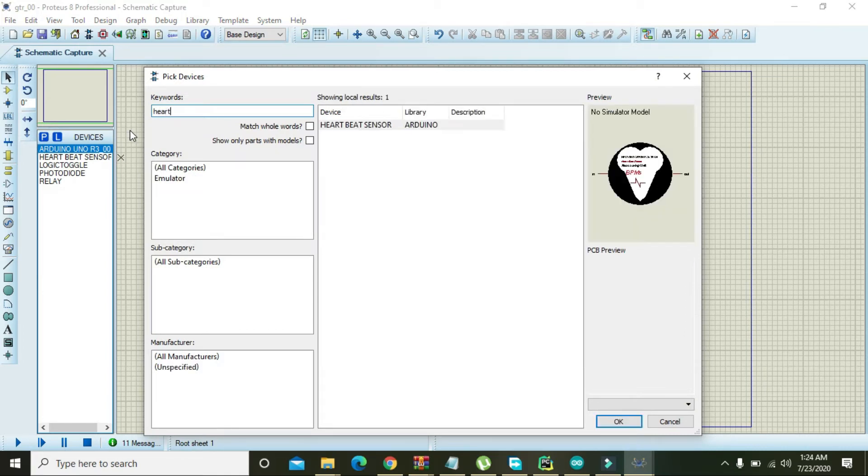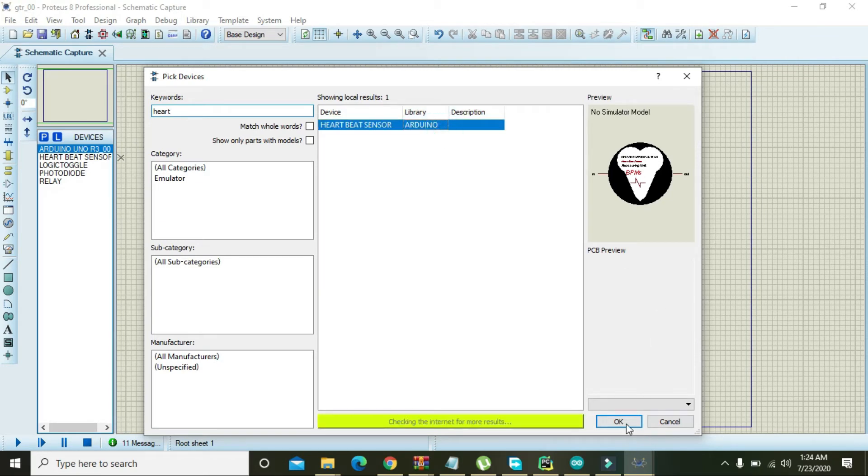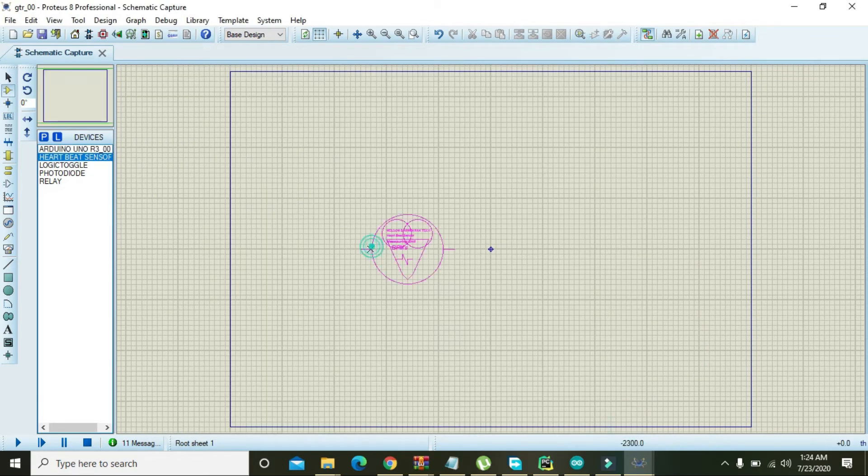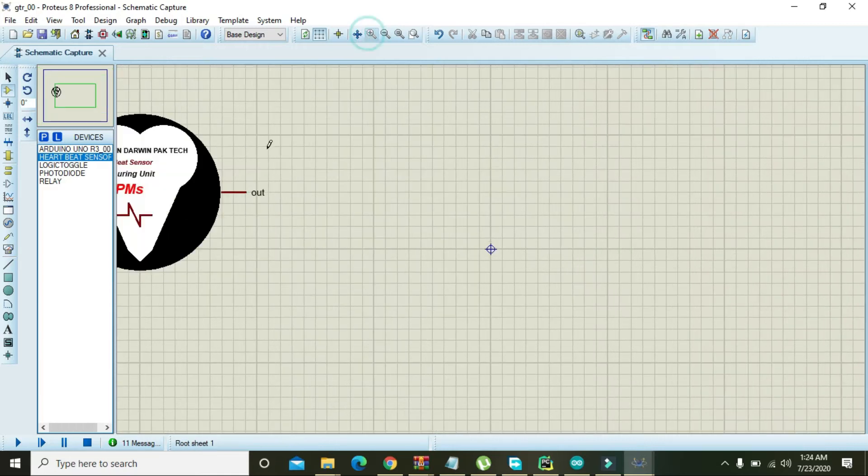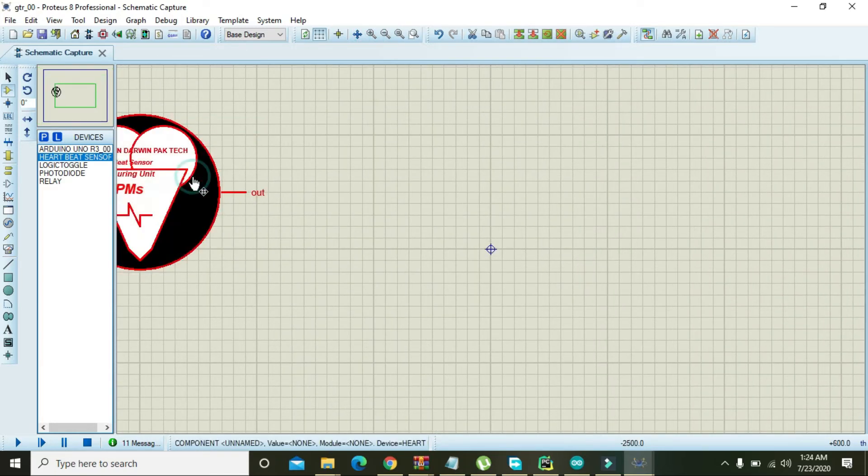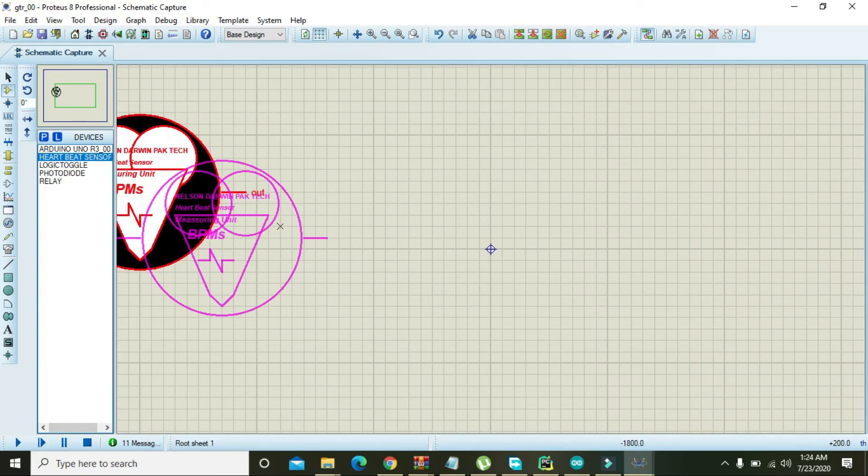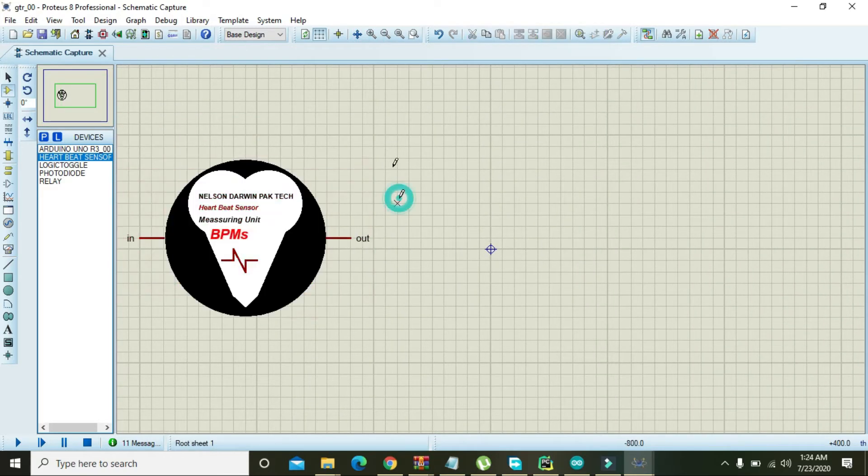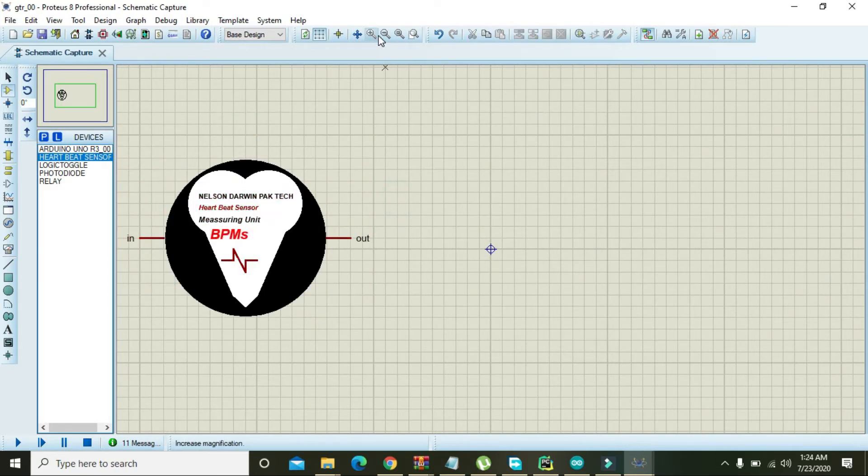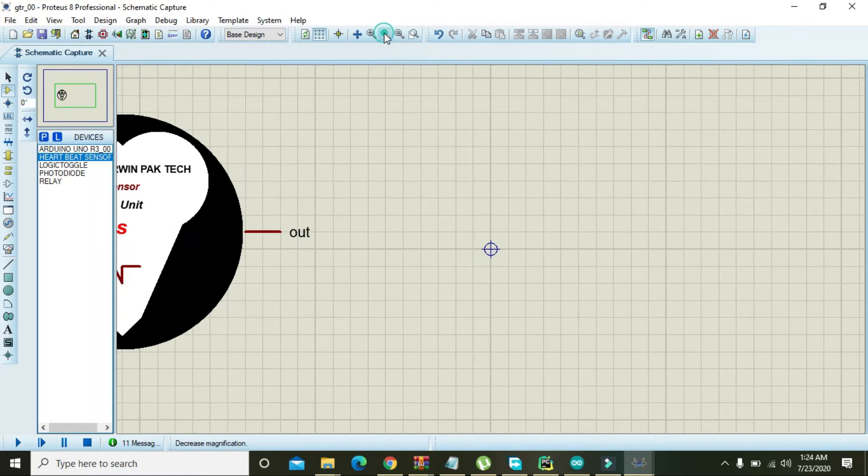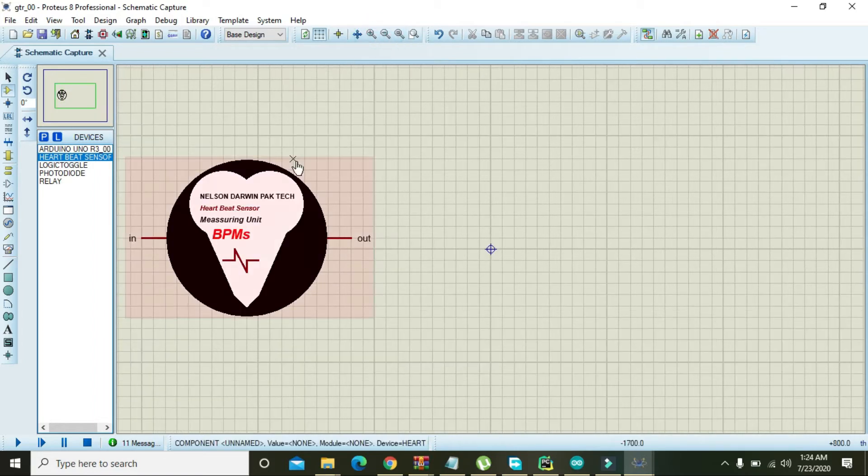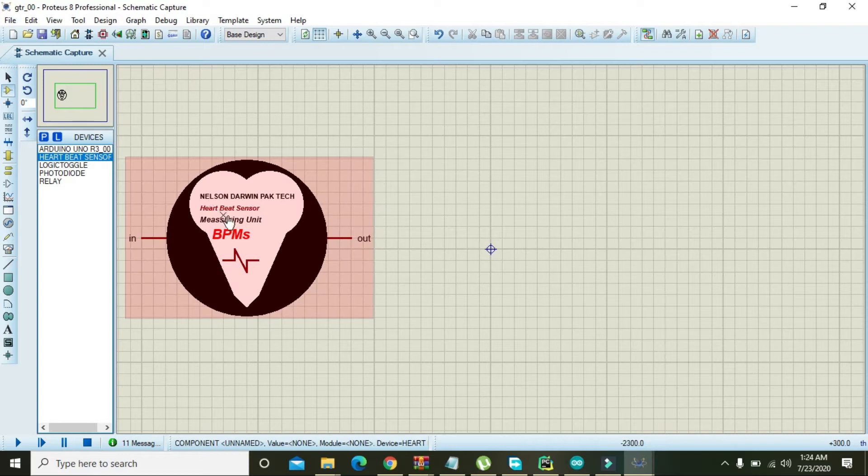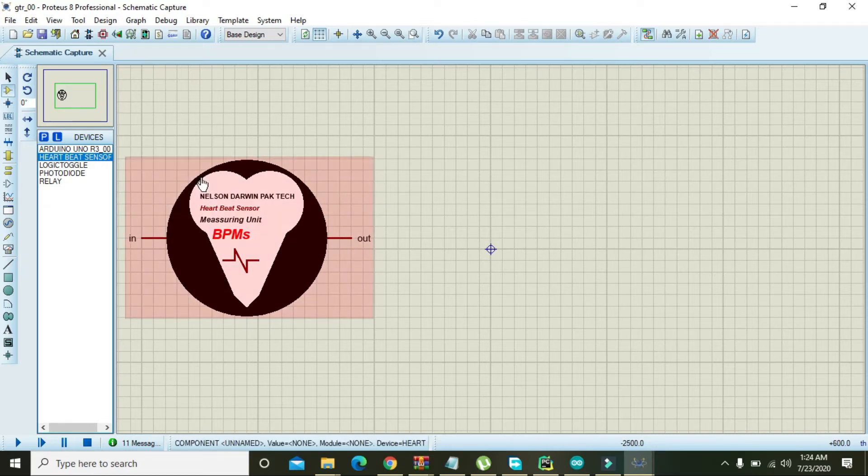Right, heartbeat, and you will get the sensor that is heartbeat sensor here. Okay, now you can place it, make it some bit zoom so that you can see it. Okay, now this is the best zoom for it.